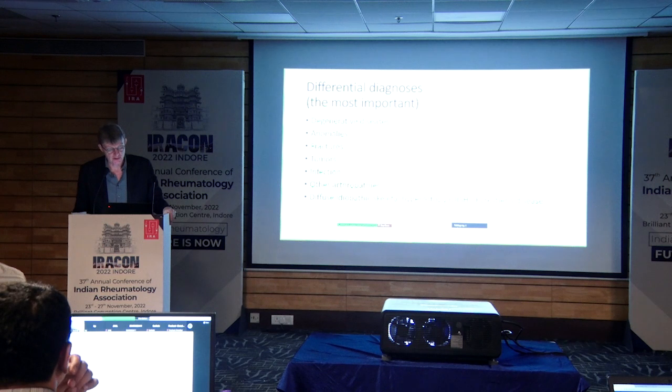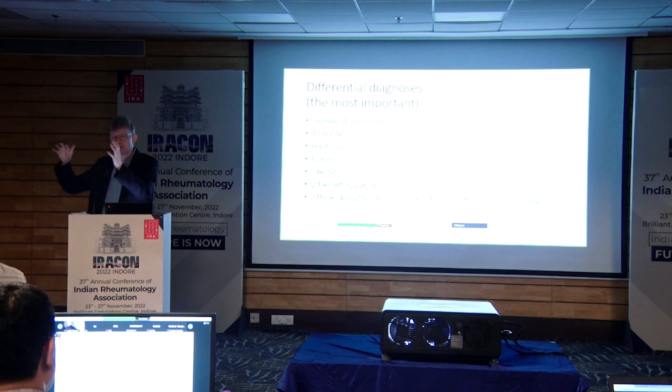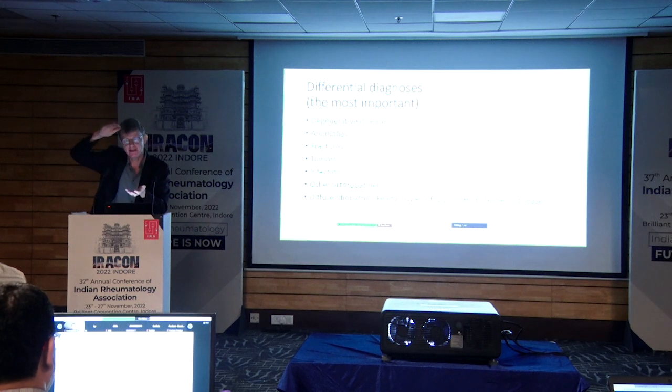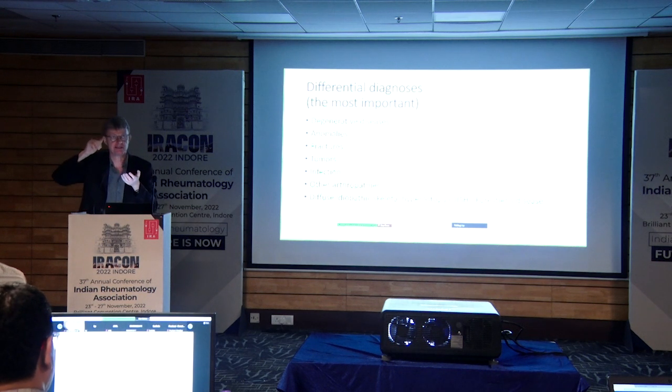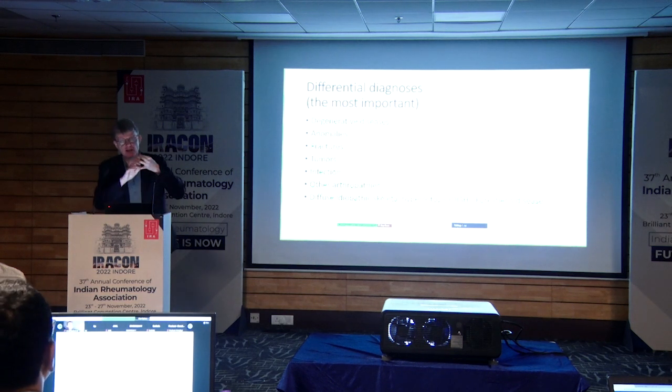Then about differential diagnosis. I think that there are, you can say, two sorts of differential diagnosis which are important. One are the severe ones, which probably our radiologists will find, and that you need to find. And that is tumors, infections, fractures, that kind of stuff. They're generally incredibly good in that, radiologists. But of course it's important to know for us as well. And then there is the other end.